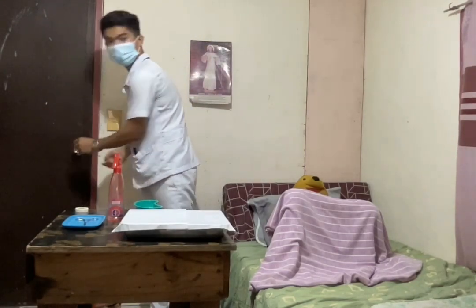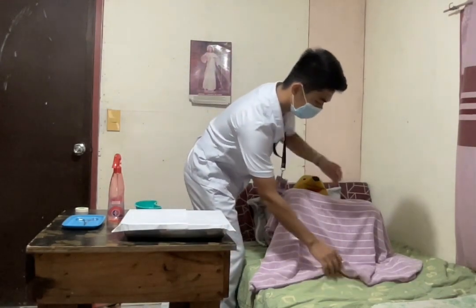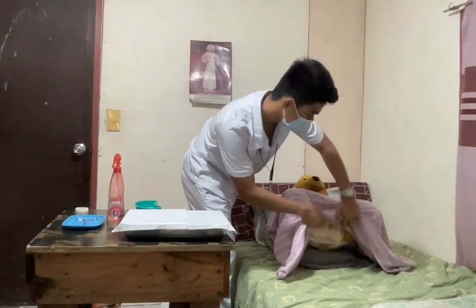Next, I'm going to close the door to provide privacy and position the patient. This respects the patient's dignity and facilitates proper access for the procedure. Then I'm going to drape the patient, exposing only the area to be used. This maintains a sterile field while ensuring patient comfort. Ma'am, I'm going to drape and expose only your genital area.